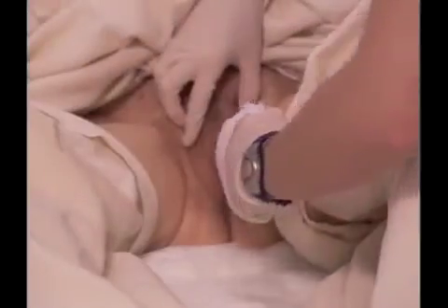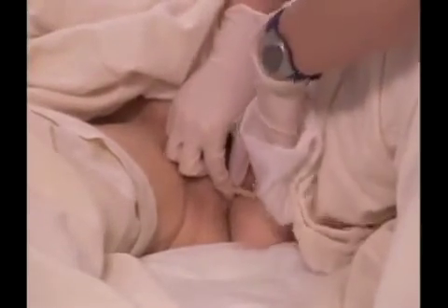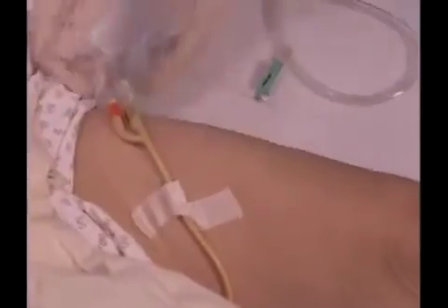Next, rinse the vulva and perineum thoroughly using your non-soapy washcloth. Then remove the soap from the tubing. Dry the perineal area and catheter tubing thoroughly using a towel. Make sure the catheter tubing is securely taped to the person's leg and check that it is free from kinks.